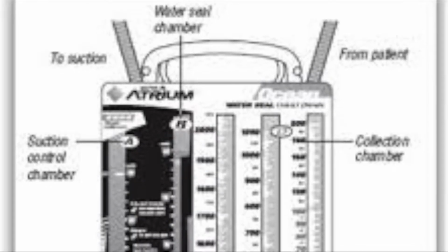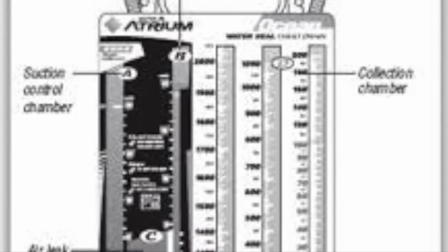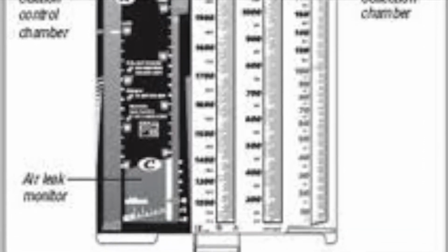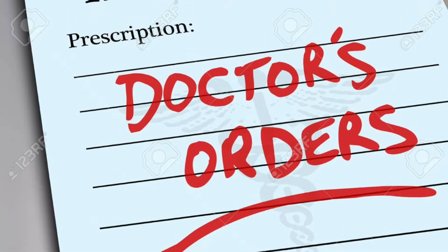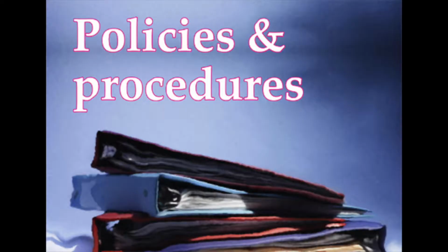If there is a cracked chest tube drainage system, first, disconnect from the system. 2. Submerge the tube in a bottle of sterile water in order to maintain the water seal. Caution: never do this without doctor's orders. Follow hospital policy regarding clamping, which can result in an increased risk of tension pneumothorax.